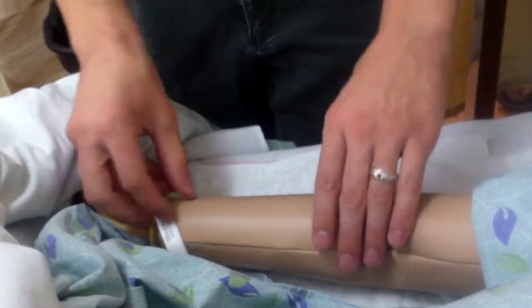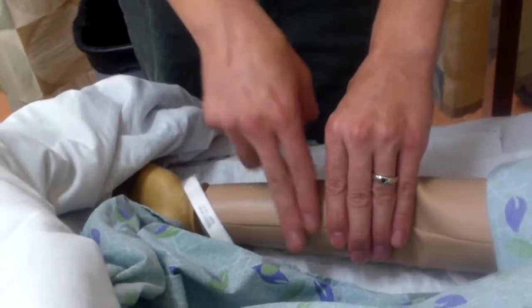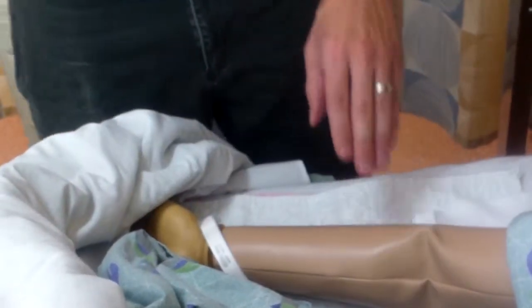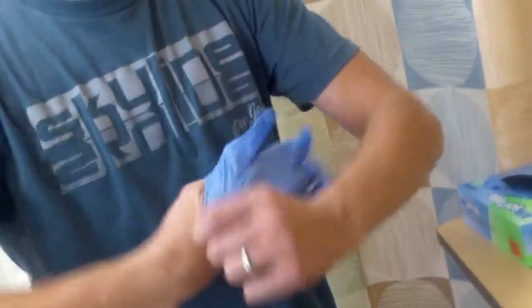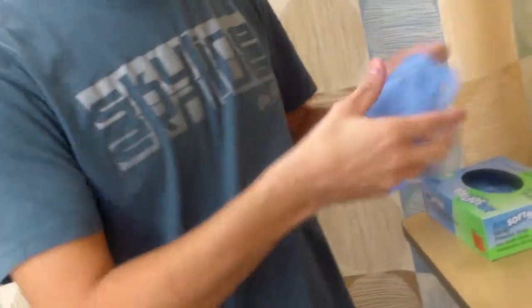Okay. So then for site finding, I'm going to find the anterior portion of the arm, 4 fingers in between, right in that spot, right about there, is where I'm going to administer that medication. So I'm going to be using this specialized pad to do it. So once I do that, I'm going to be putting on my gloves. Putting on gloves that actually won't rip.